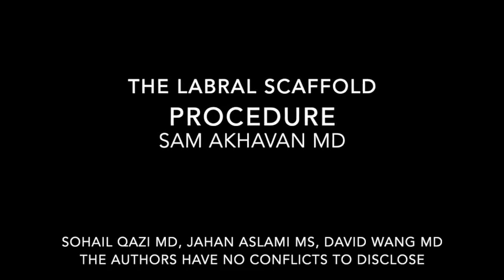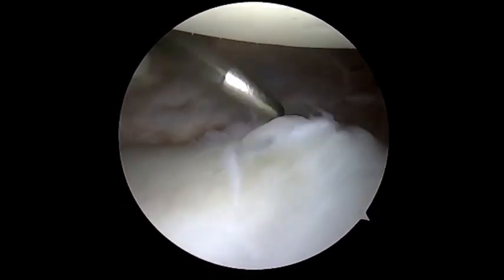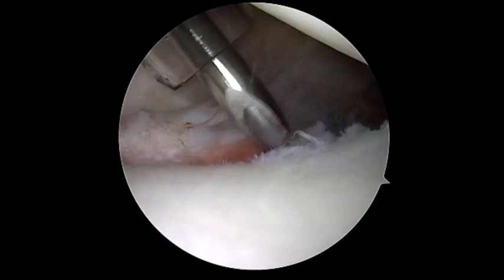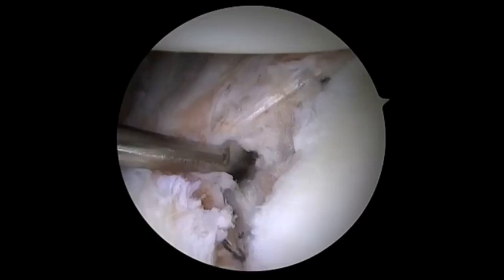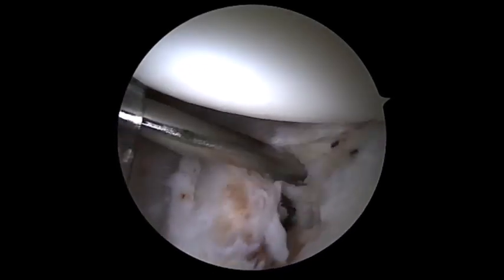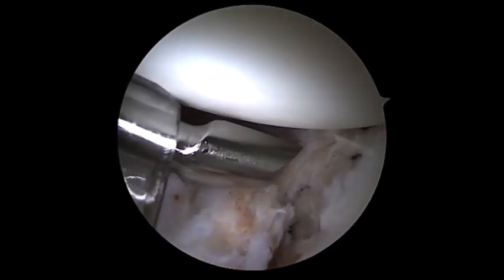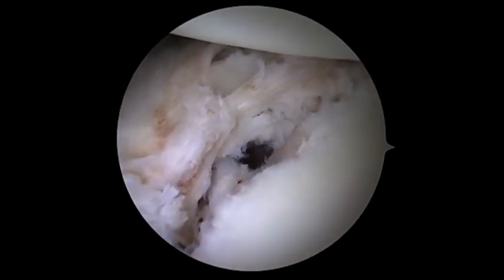This video will describe the labral scaffold procedure. This is a 22-year-old patient with a labral tear from a previous labral repair. She had redislocated. The previous sutures are removed and a pocket is created in the area of bone loss. In this particular case, the patient had a 5 millimeter area of bone loss.